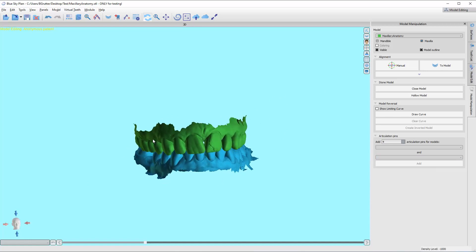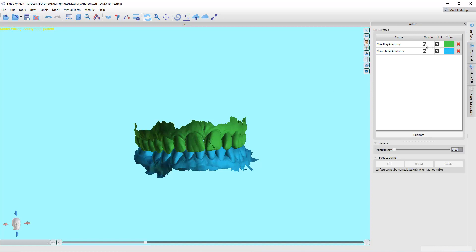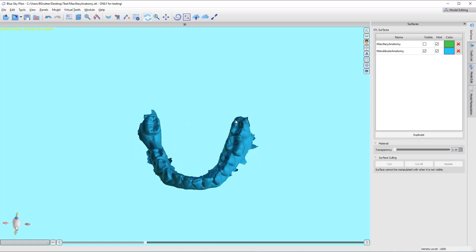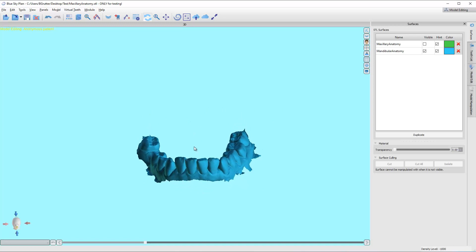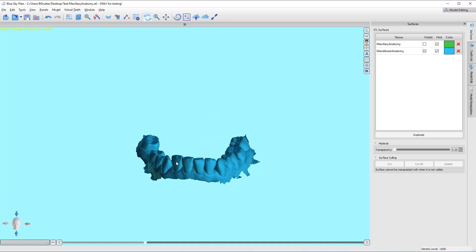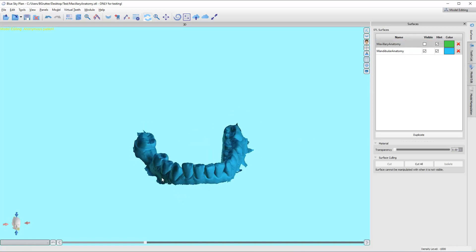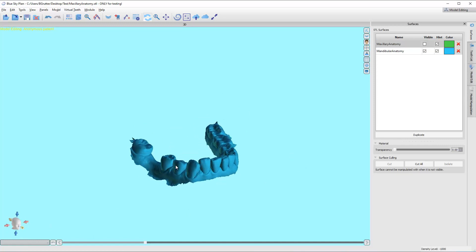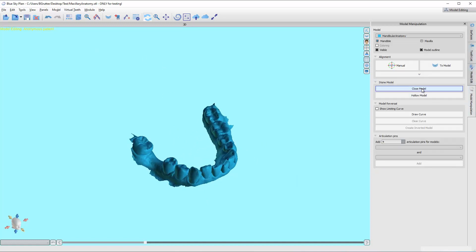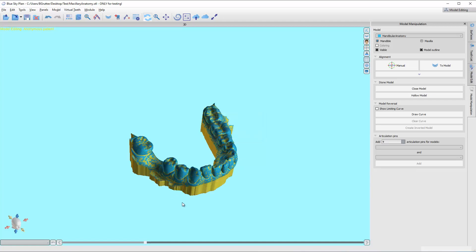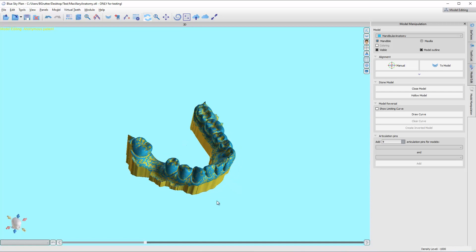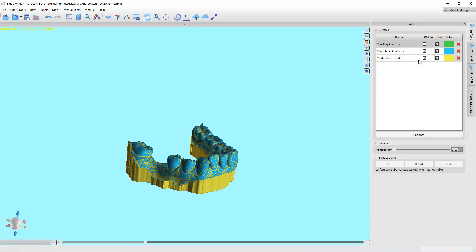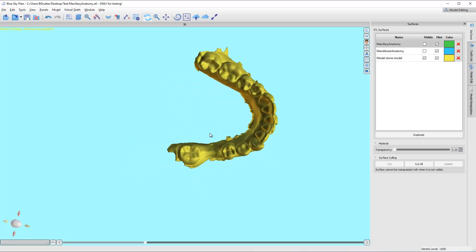Now what we're going to do is the very first thing I'm going to do is I'm going to close this model. I don't need the upper visible, but I do need to have it in here. It is critical that you bring the upper into this environment because I've just moved the alignment. I'm going to come over to model manipulation, and I'm just going to click on this button that says closed model.